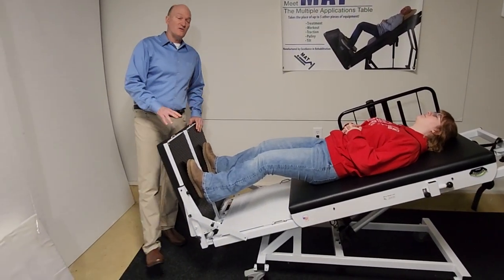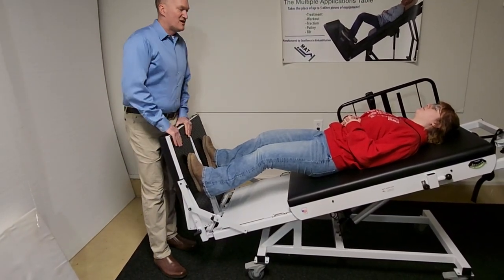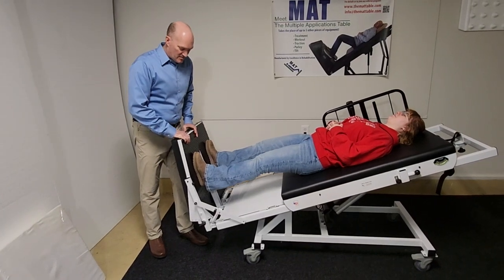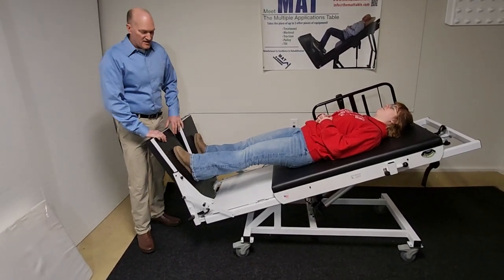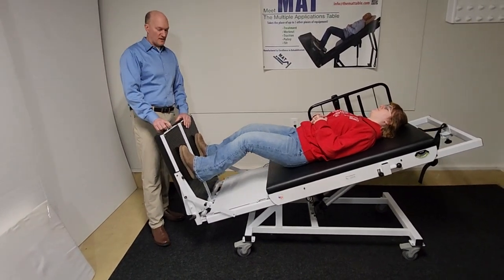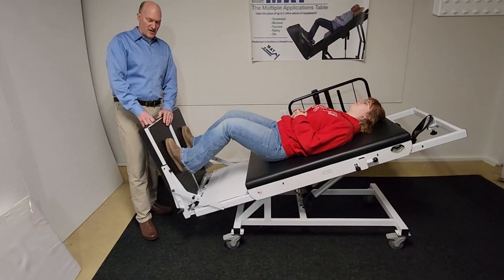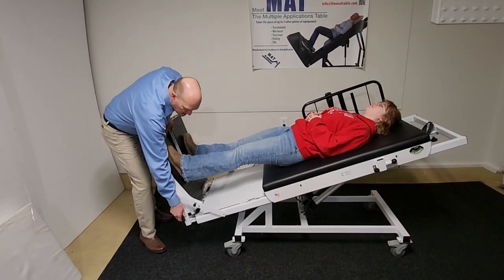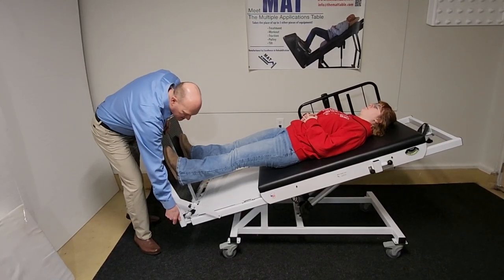What this table does that no other table in the world does is the ability to dynamically exercise the ankles. Keep your knees straight — toes up and toes down. If someone has had a stroke or for whatever reason has a fused ankle — I've had plenty of patients that have had fused ankles — this will accommodate that. You can also adjust it in five-degree increments of dorsiflexion and plantar flexion to compensate for whatever the patient may need.